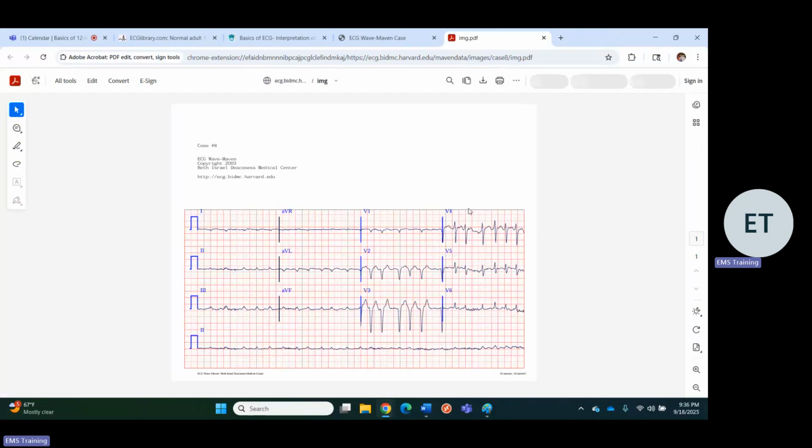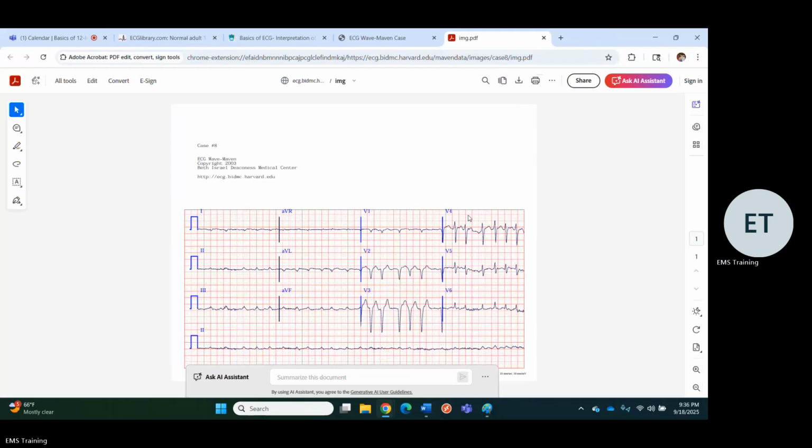Four. All right. Wow. Normal or abnormal? Very abnormal. Fast or slow? Fast. Axis. Looks like it's primarily down here, primarily up here. That's right axis deviation. The rate is irregular, and I don't see any atrial activity. The QRS complexes are very wide. And the QRS amplitude, or the voltage, is very low everywhere except for here. So it's a very abnormal EKG, concerningly so.